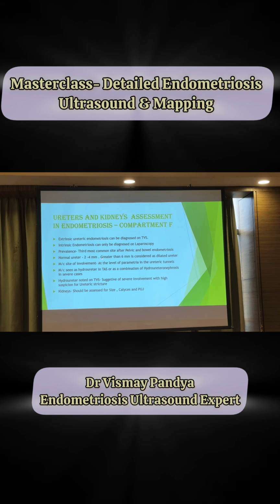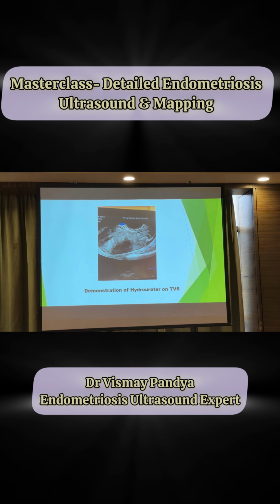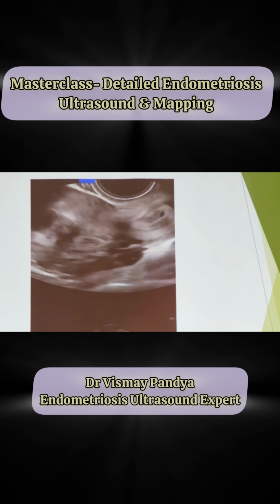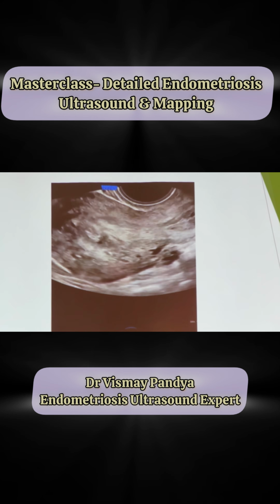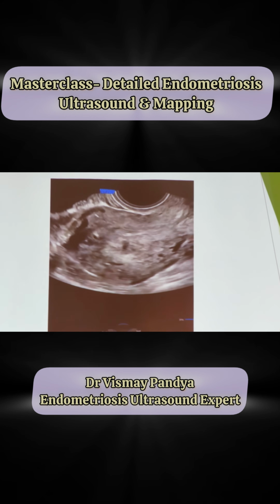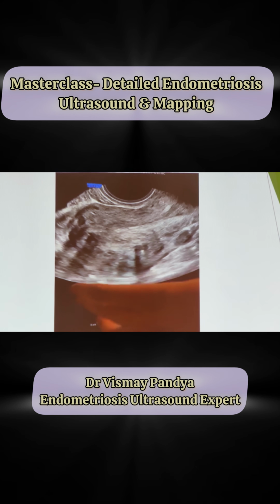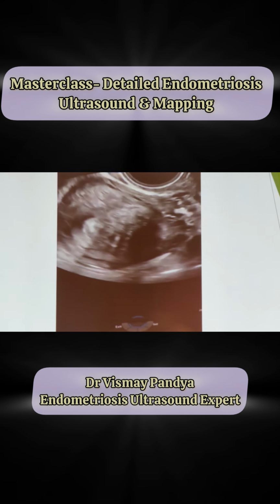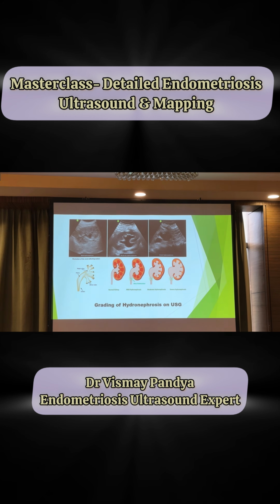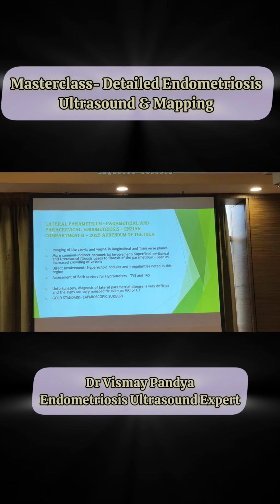Ureters and kidneys are, we all know, a common site. And this is the video for the case which I showed for hydroureter. We know the grading of hydronephrosis: severe, moderate. And this is just a short point on the lateral parametrium.